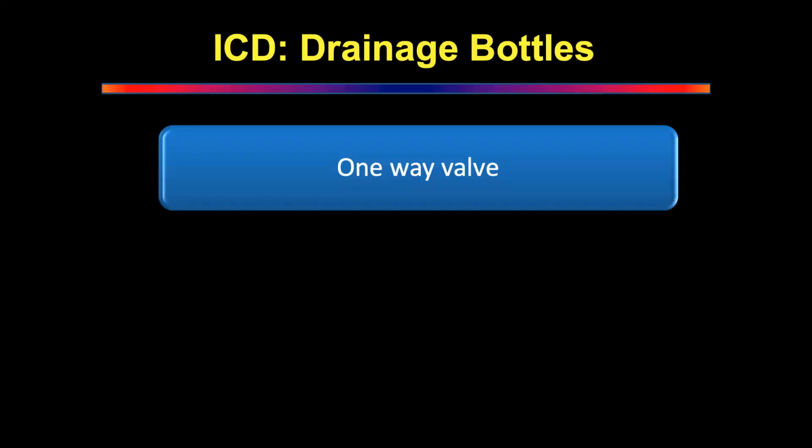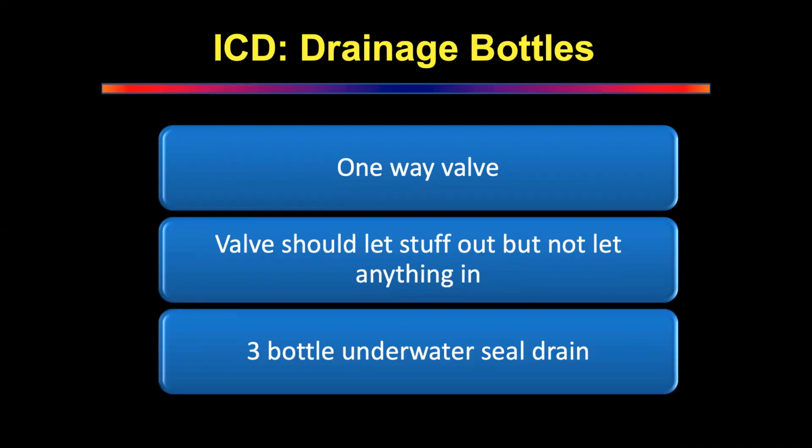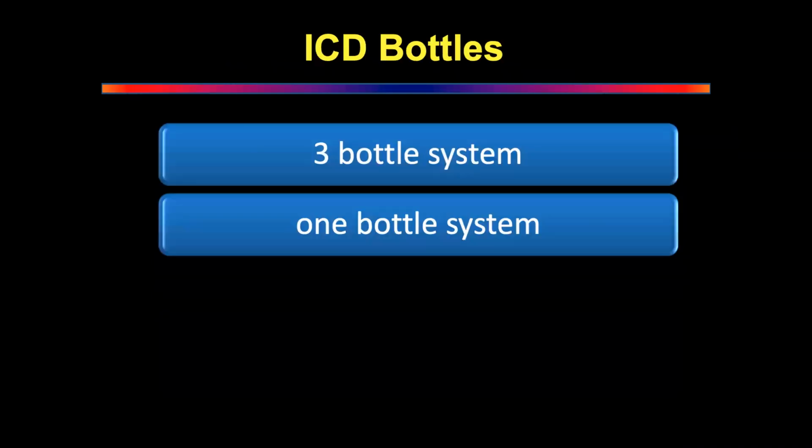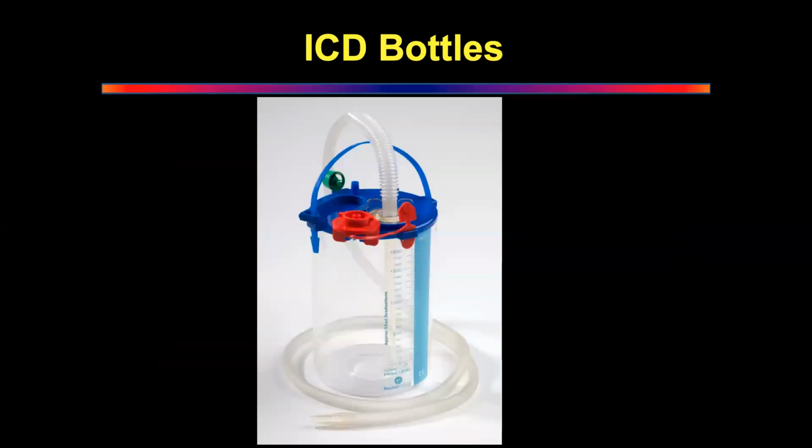That's what you want to make sure. Okay. So the valve should let stuff out and let nothing back in. Okay, that's the philosophy. We're talking about the philosophy of drains. Okay, so there are many different devices that are available. Let's just go one by one.